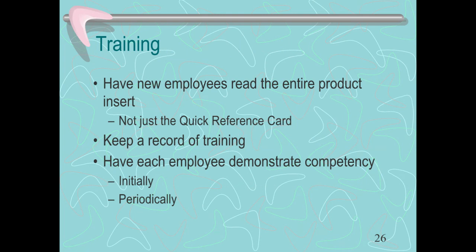Training: there are always quick reference training cards to remind you how to do your testing. That's great. But you also want to make sure that you as a new employee not only read it, but you have someone train you on it and that you're checked off on it. And if you have to train someone, make sure that they're competent, that they can do the testing. Make sure someone's checking you guys off regularly. That should be part of your yearly evaluations, to make sure that you're doing these things correctly so that you're not getting sloppy. So training is important.